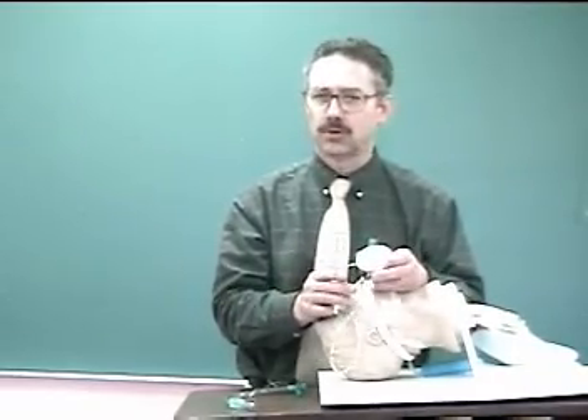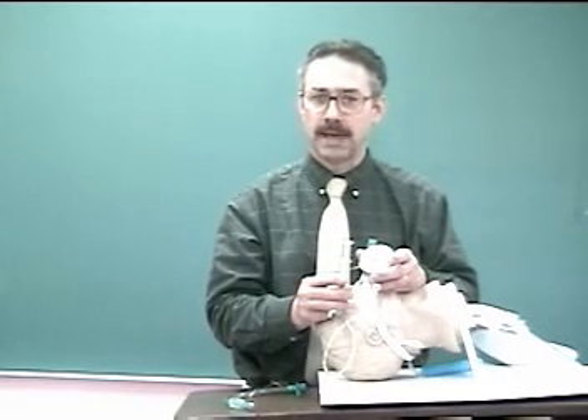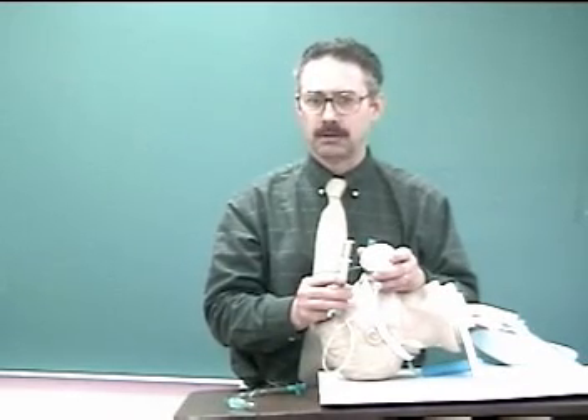As we saw in the lesson, there are three different ways of doing cuff pressure. That's MOP — minimum occluding pressure; MOV — minimum occluding volume; and minimum leak technique.